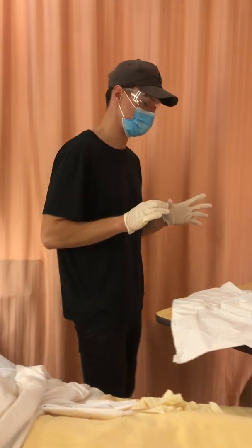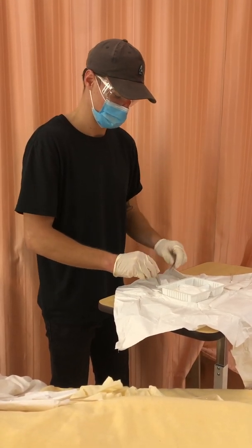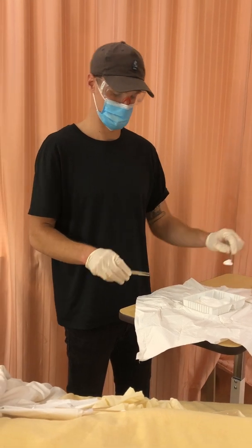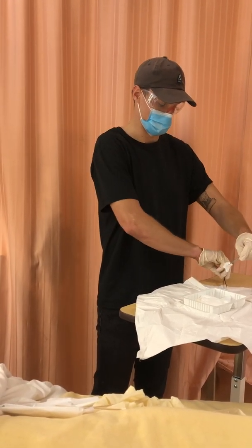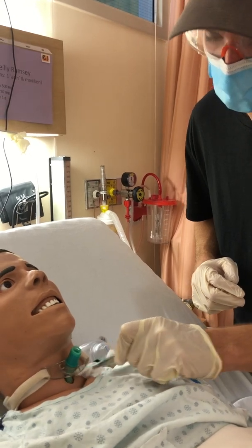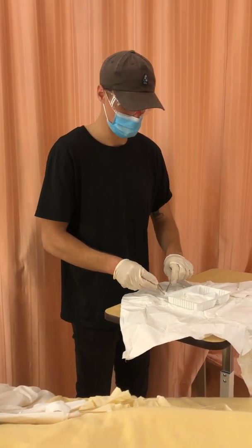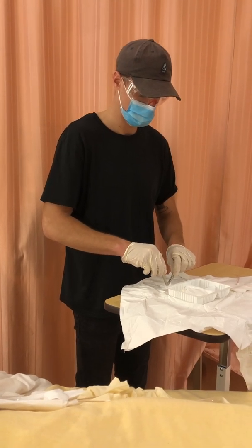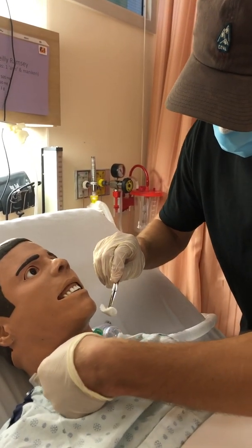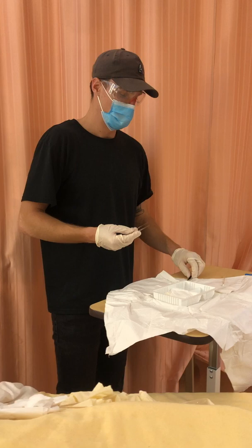That's clean, and then I'm going to go with some 2x2s and clean on the bottom of the trach and the top of the trach as well. Dab a normal saline, dry, and that came apart. Obviously this would be a lot better. One side down there. Second one here. Saline, dry, and then I'd ask a second nurse to open this up here. Do one more swipe, drop, and then I dry.